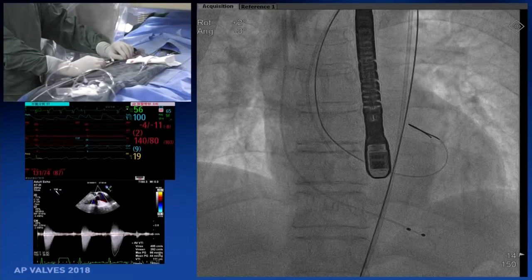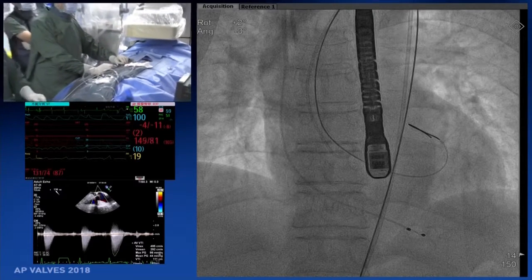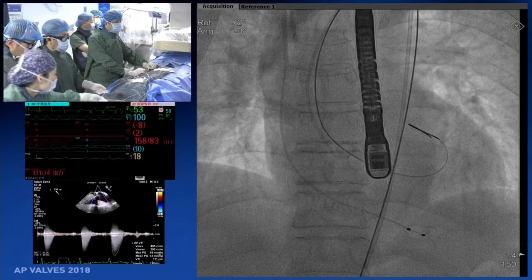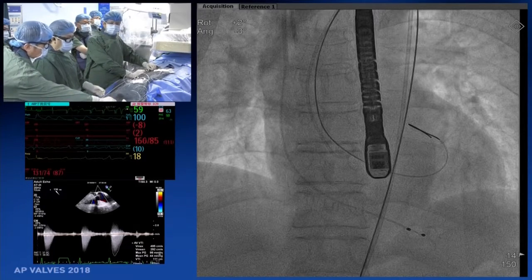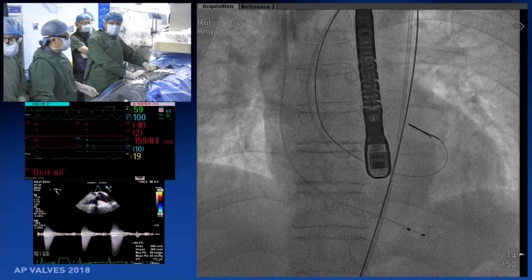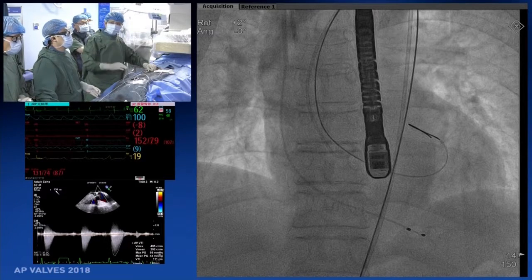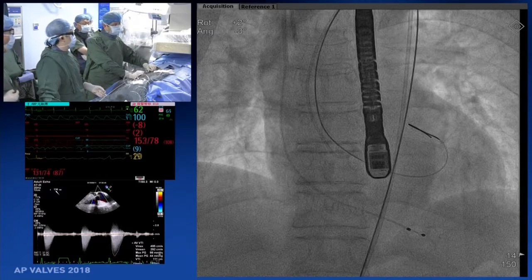For this sort of small LV with a very small size, what will be the preferable type of guide wire that we can use? Suppose we have free choice of many types of guide wire. I think the best one is a Safari. Yeah, small curve. I like the Safari. The tip is a circle and the wire is not so stiff. It's not easy to cause damage to the ventricular muscle.